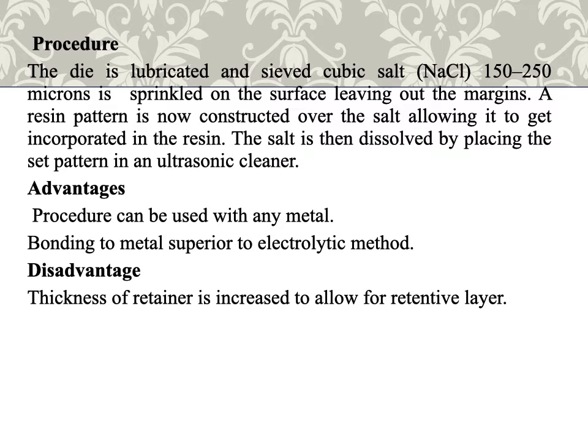The advantages are the procedure can be used with any metal, and bonding to metal is superior to the electrolytic method. The disadvantage is that the thickness of the retainer is increased to allow for the retentive layer.